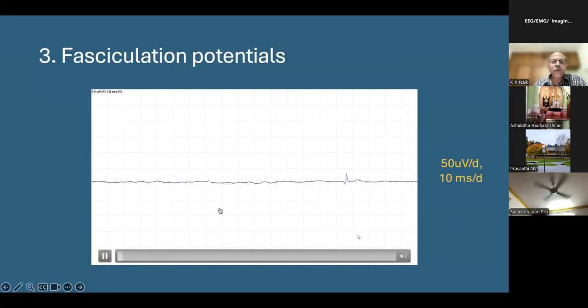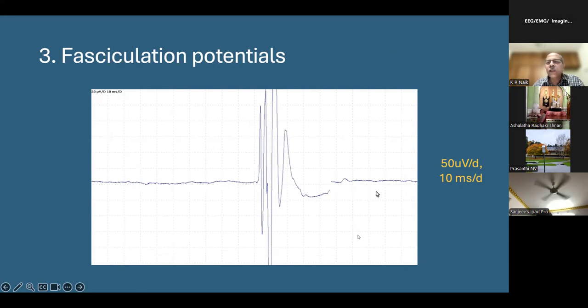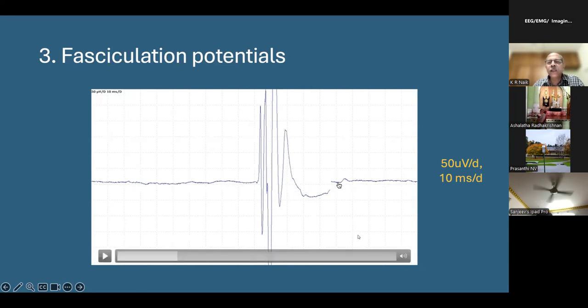This is a fasciculation potential. So this is a big potential here. Multiphasic, polyphasic, duration around 30 milliseconds, 40 milliseconds.